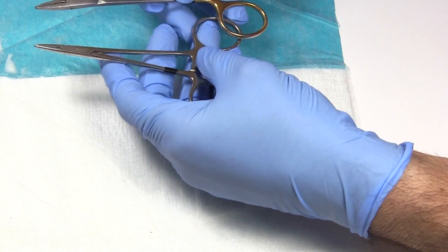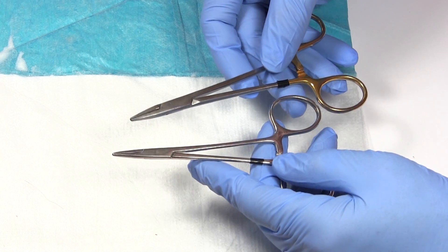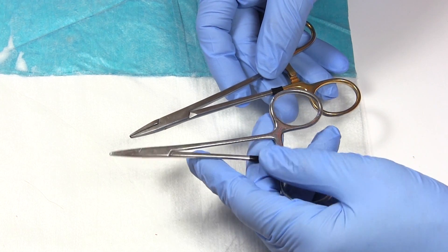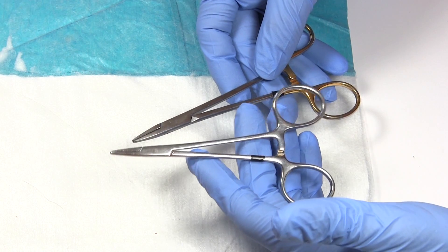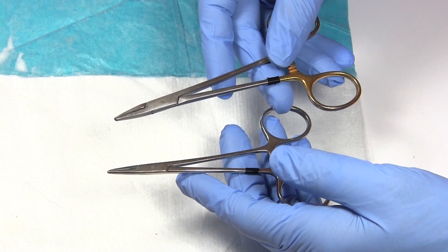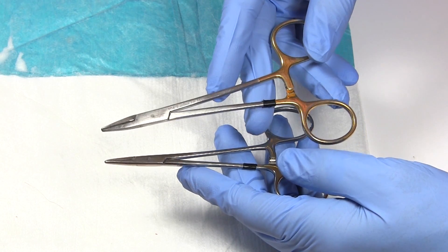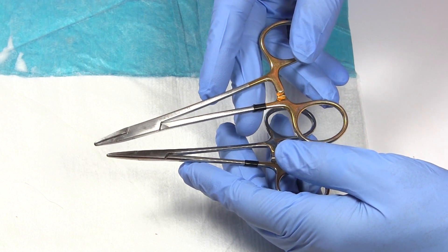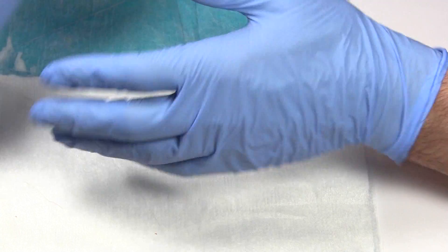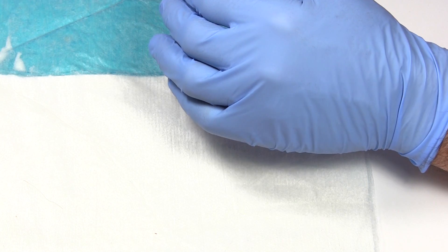First I'm just going to cover the basic equipment you need for sewing. You need needle drivers. Needle drivers come in several sizes — small and large. I generally use a smaller needle driver for smaller needles, 5-0 and smaller thread, and a larger needle driver for larger needles, usually 4-0 or 3-0, which is the bigger size thread.